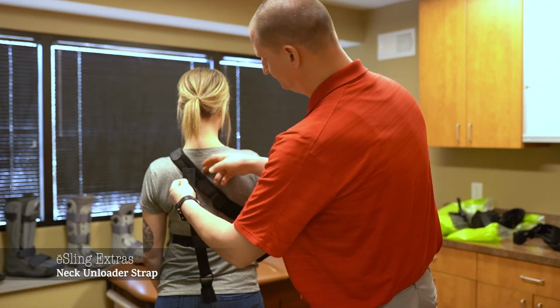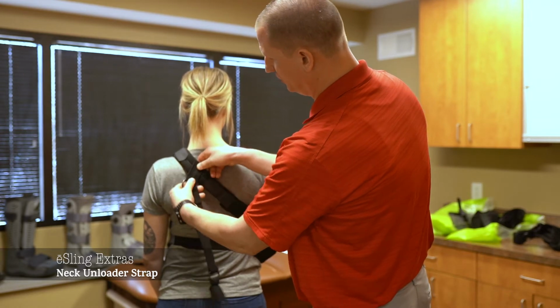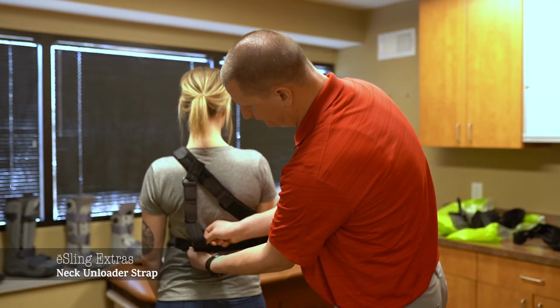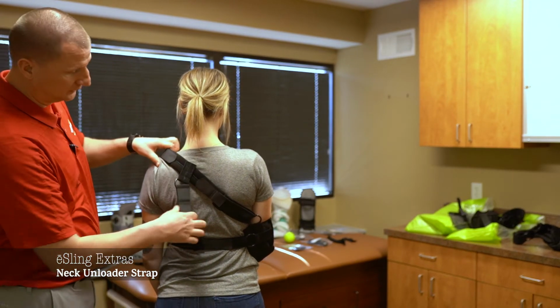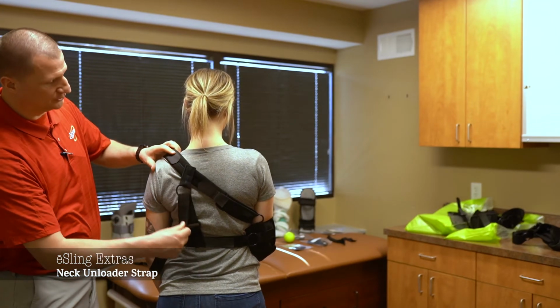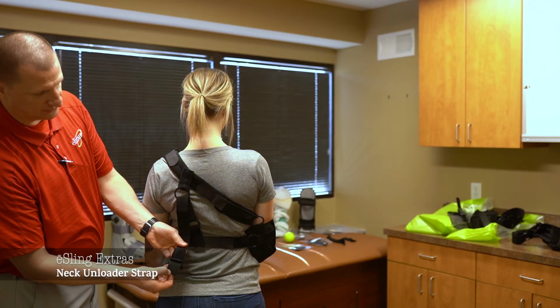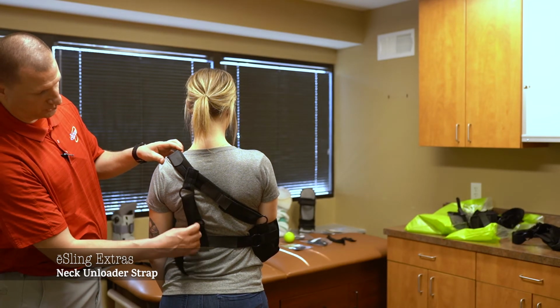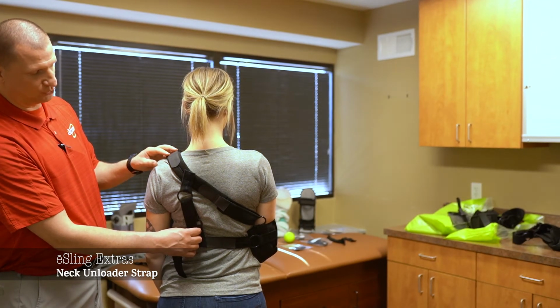With the Y straps and with the Velcro facing you, you're going to attach this to the crossbody strap and also attach it to the waist strap. As you are pulling this away from her neck, you're going to fasten this strap down. This will hold the strap away from her shoulder. You would optimally want to cut this utilizing the Y strap, and it would be Velcroed on the back side of the patient along the strap here. This will hold the strap off of her neck and make the strap more comfortable for her to use the sling.